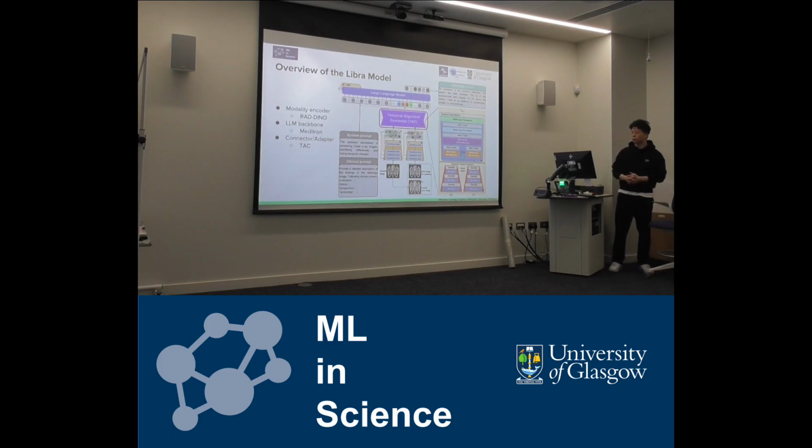Now let's talk about the connector. The model uses a hybrid structure that combines a convolutional neural network and transformer blocks, allowing it to precisely align the temporal features between the paired scans for each input. One challenge in real-world datasets is that not every scan has a prior study available.